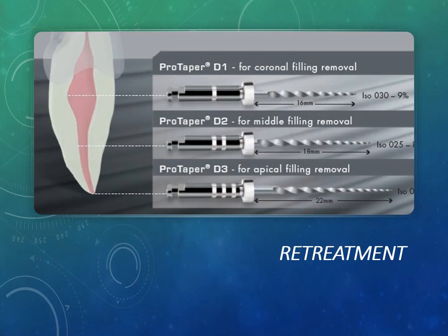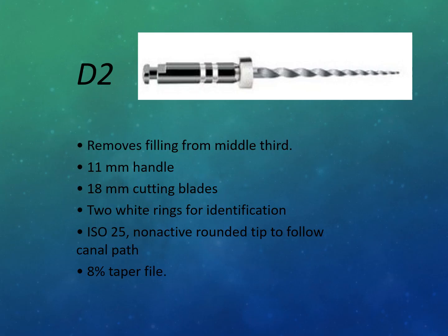And yeah, the same retreatment files which I have mentioned, D1, D2 and D3, same thing.